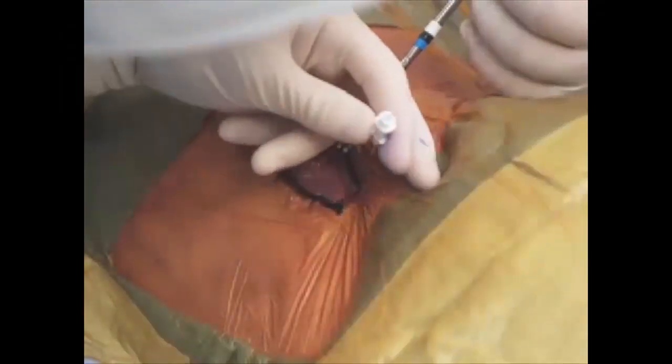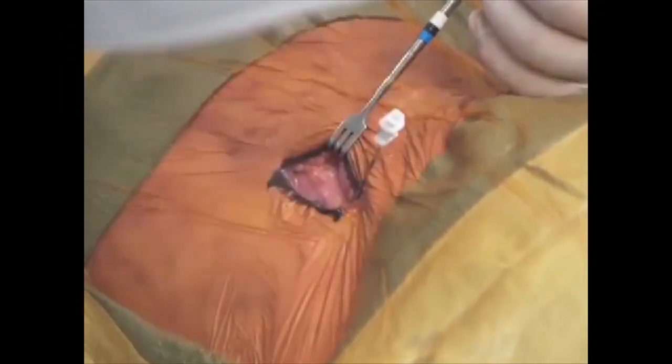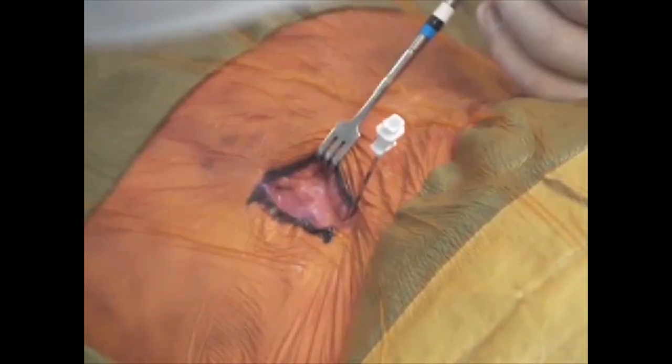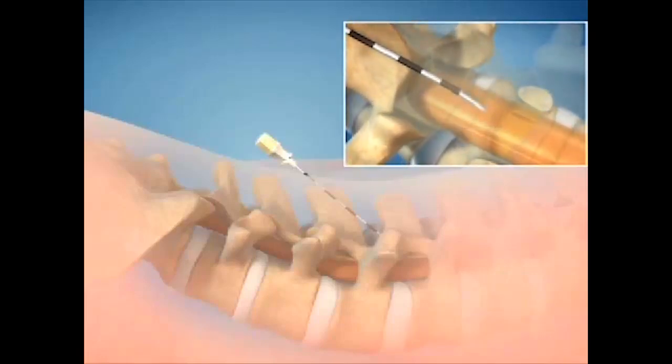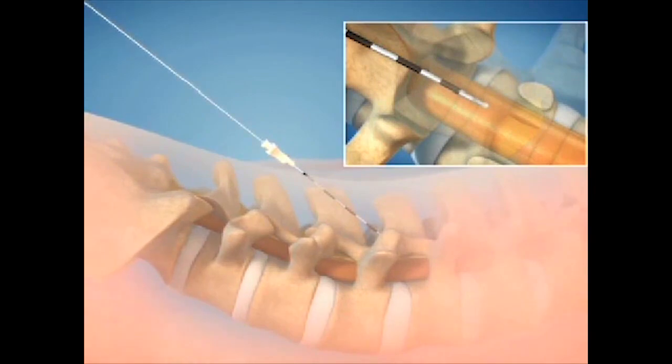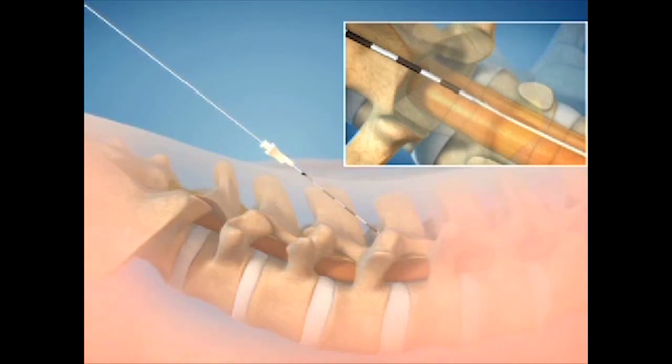Before introducing the catheter, verify the bevel of the needle has a cephalad orientation, making sure the key of the stylet cap and the orientation indicator on the needle hub faces up. Then, remove the stylet and confirm the catheter is fully inserted within the channel of the guidewire handle. Thread the spinal segment of the catheter through the needle to the desired vertebral level. Expect a slight increase in pressure when the tip of the catheter reaches the curved point of the spinal needle.